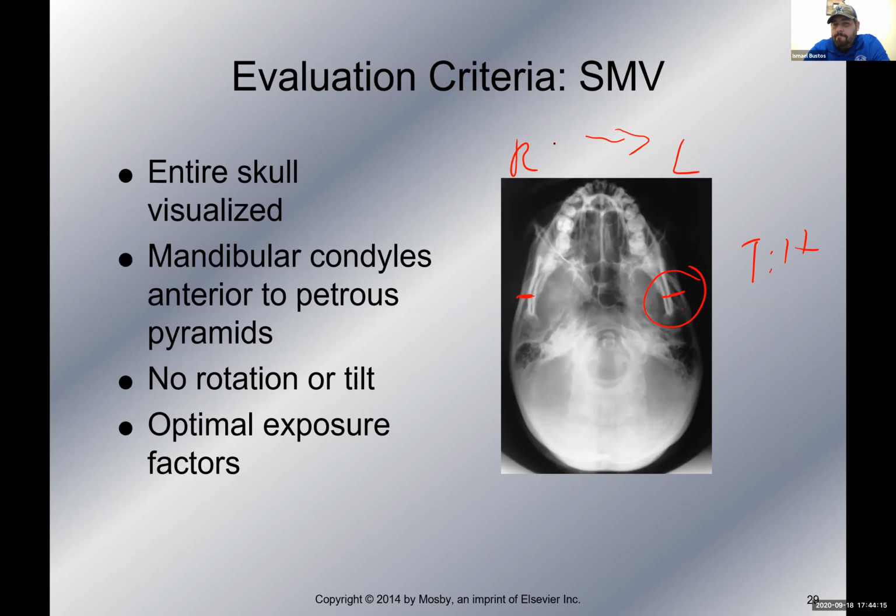All right. And then, of course, optimal exposure factors, sharp lines, bony trabecular markings.